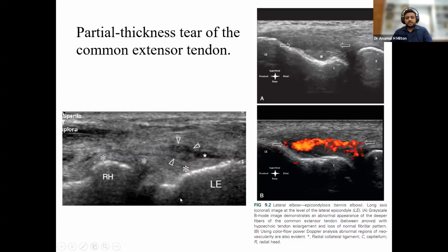Okay. Above the slope is the tendinous part, but the lower part of the slope is only for the lateral collateral ligament. So these are the muscles, which come and are converted into the tendon. Here we can see the small partial tear.